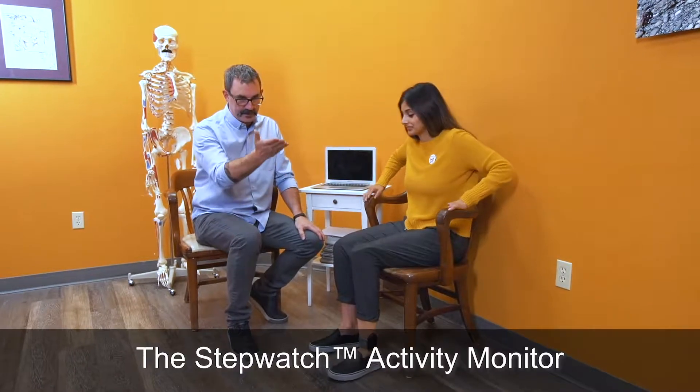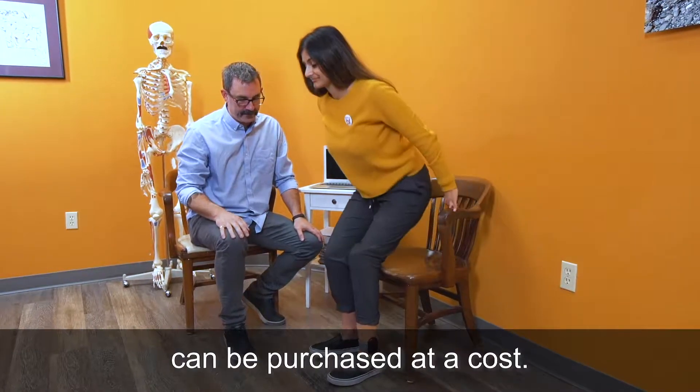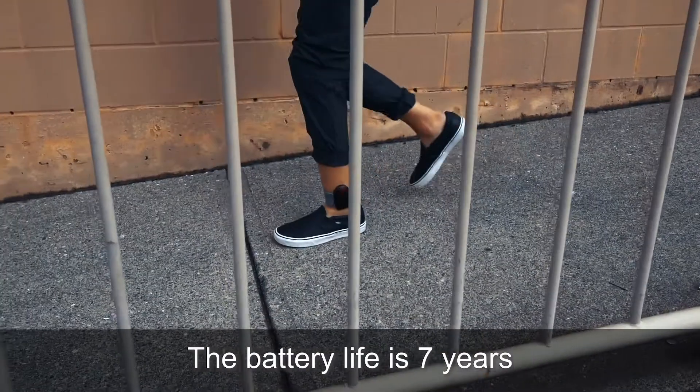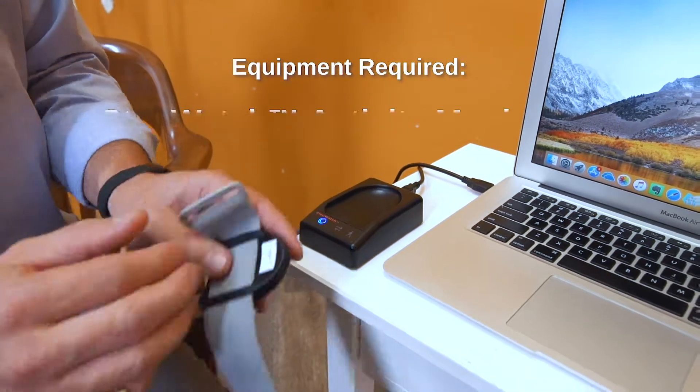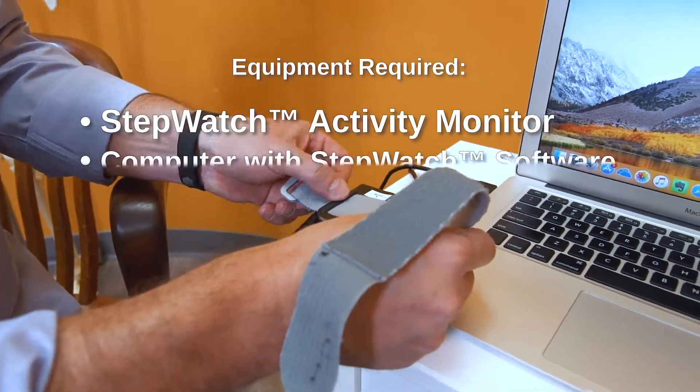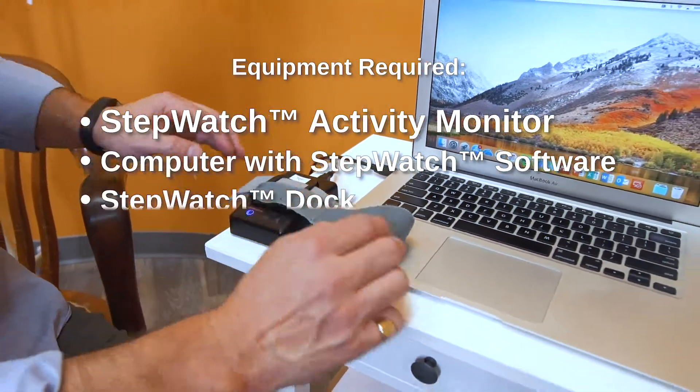The StepWatch Activity Monitor, dock, and software can be purchased at a cost. The battery life is seven years with constant use and is not rechargeable. The equipment required is a StepWatch Activity Monitor, a computer with StepWatch software, and a StepWatch Dock.